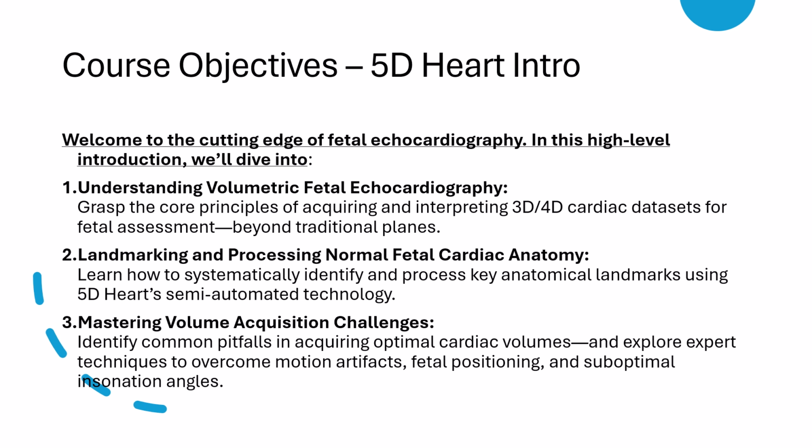The goal of this mini course is to empower you with practical insights that elevate your confidence and precision when using volumetric techniques in fetal echocardiography.